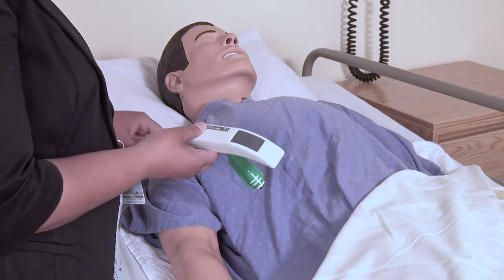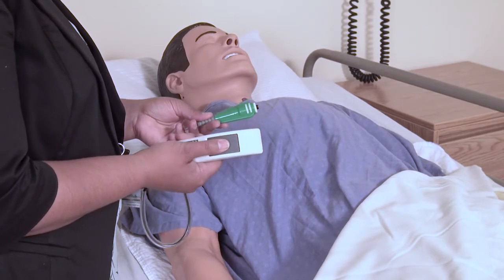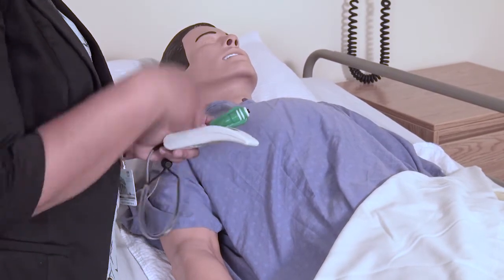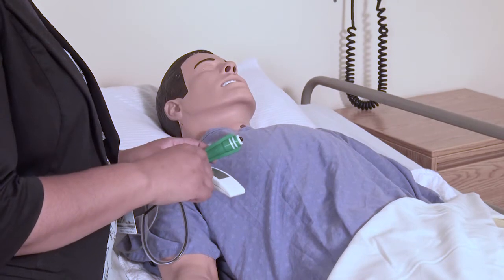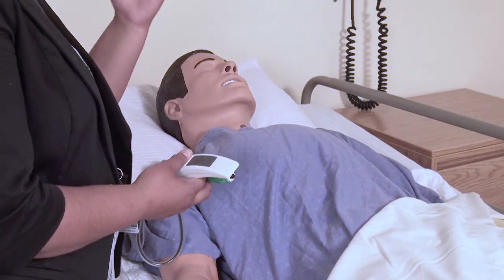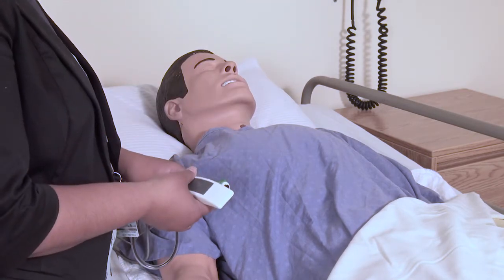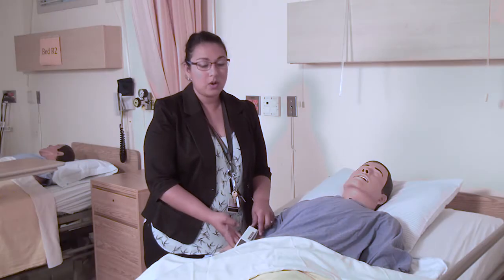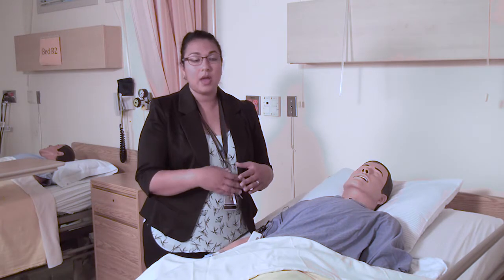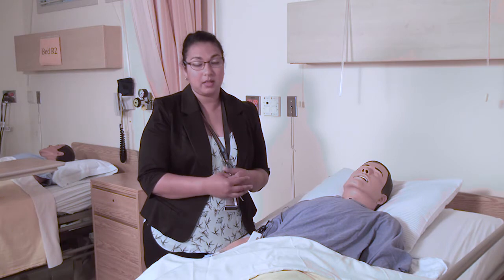Now, these are two examples of buttons. You'll only give one button to the patient, and they need to know how to press the button, what the sound is when they press a button, and that when they get that sound, then they're actually administering their own dose of medication. And then also with their pain level, and how is their pain level, and when to press the button with their pain level.